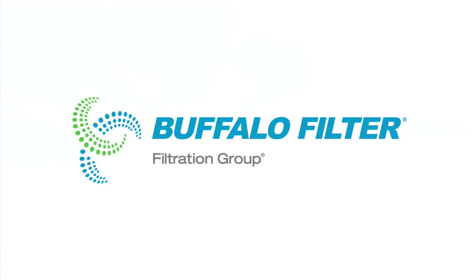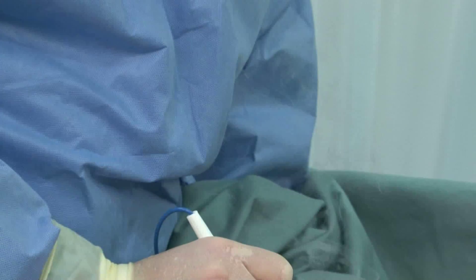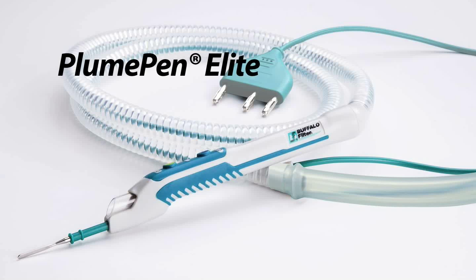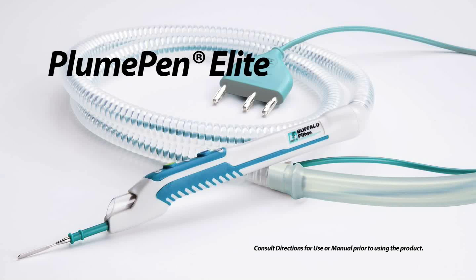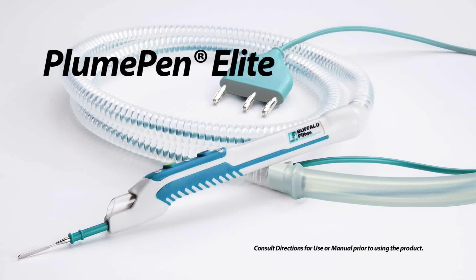Buffalo Filter. Don't let surgical smoke plume cloud your visibility. Pushing the boundaries through design innovation, Buffalo Filter is pleased to announce our next generation surgical plume evacuation pencil, Plume Pen Elite.